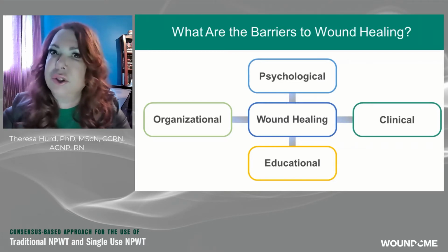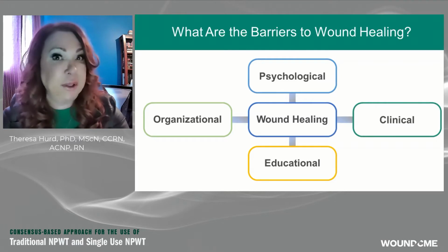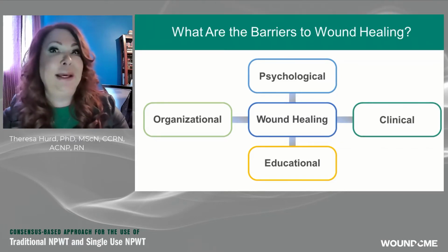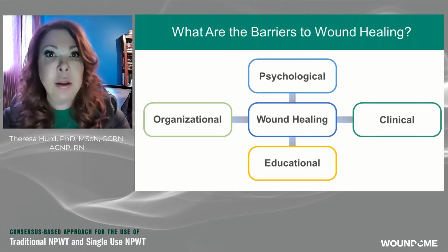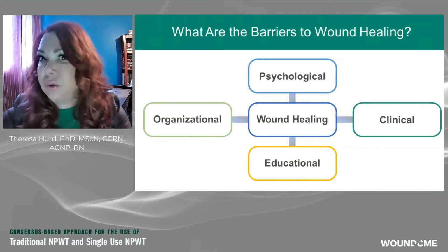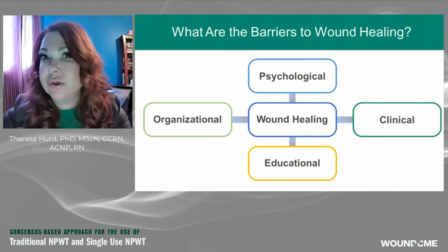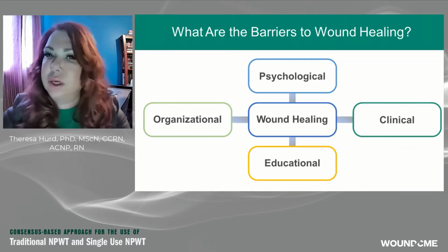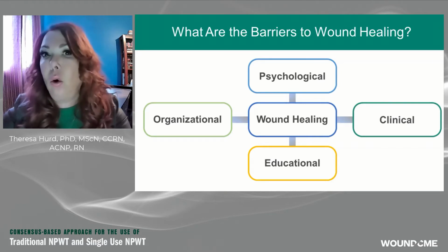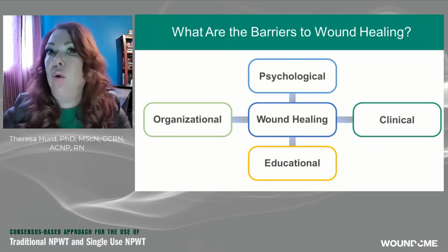Well, if we're starting to look at treatments such as negative pressure, if we're looking at what we call traditional negative pressure, the literature has told us, and many of you have experienced this, that it might not be such an easy treatment for patients to do. In other words, if the skill is a little bit more complex than other skills, then perhaps if it's not reinforced continually, or it's a hard skill for me to take, I won't be able to do that.